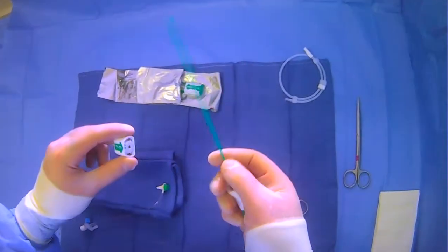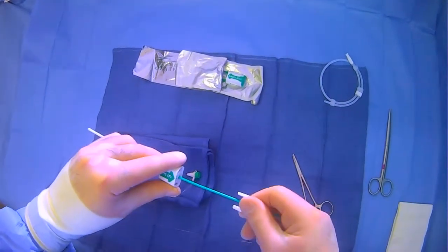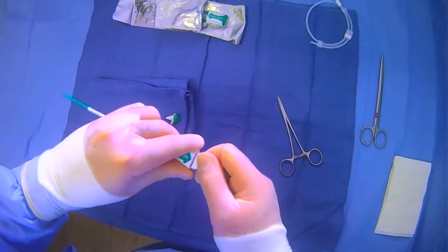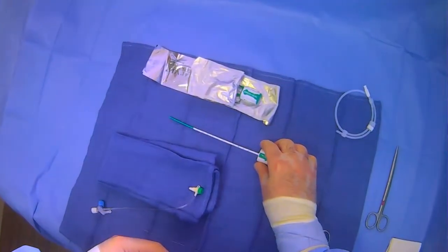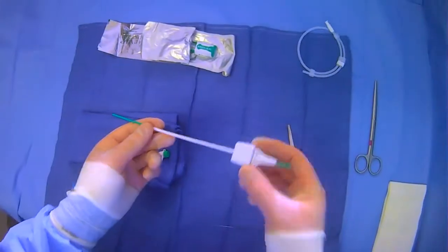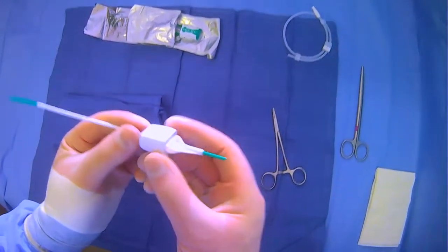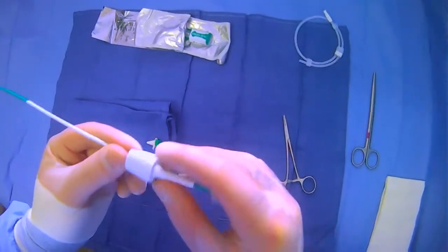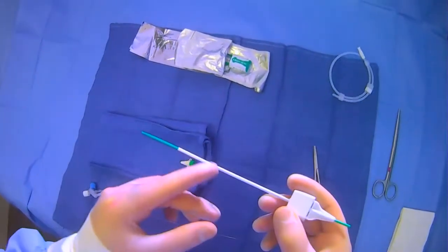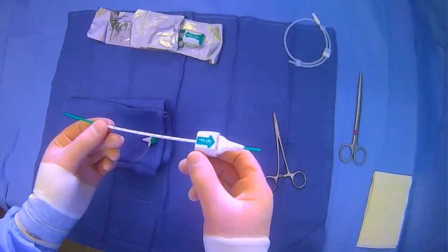To get started we'll put together our introducer here and we'll make sure that the arrows line up. When we're inserting this introducer, we will insert it in this orientation because it's tapered, and then once we get blood that comes out of the hole here we'll flip it over. We'll start by loading it this way, and once we get blood — confirming we're intravascular — we'll flip it and go from there.